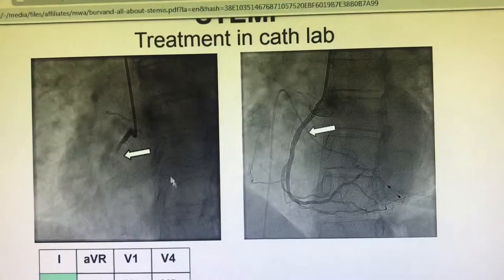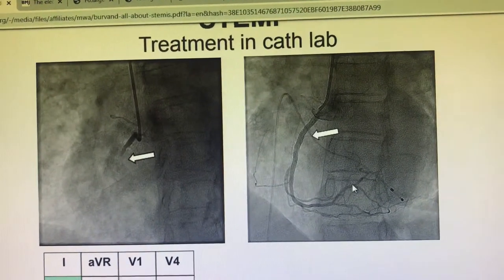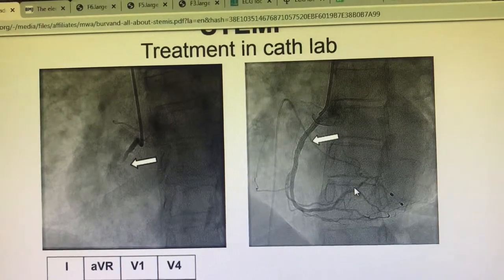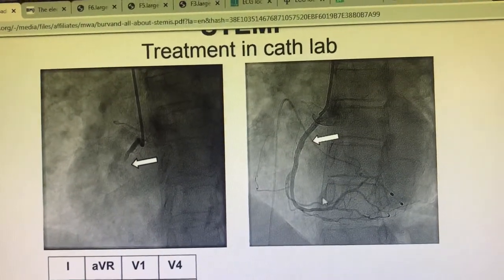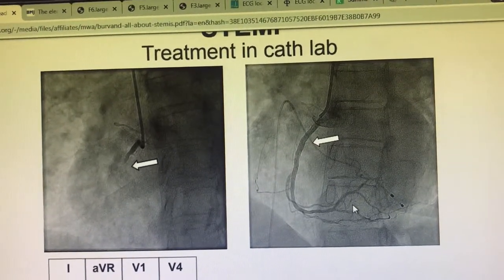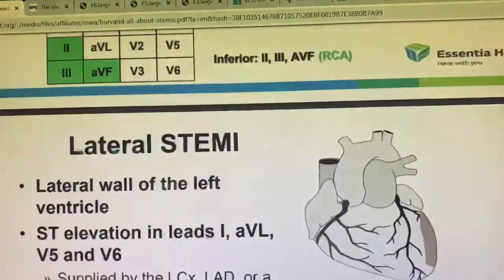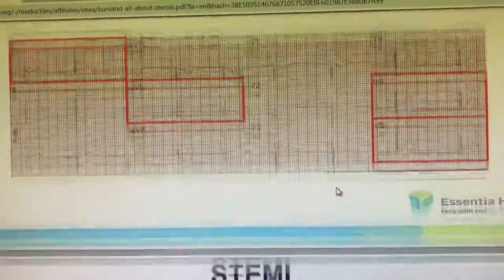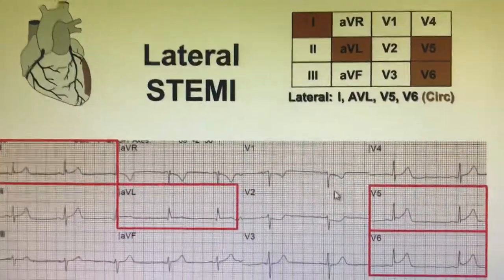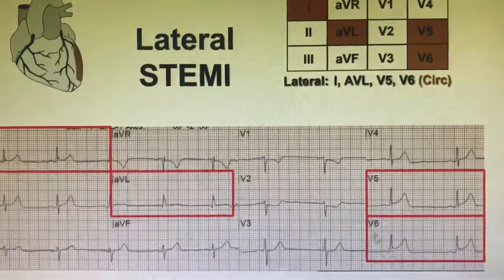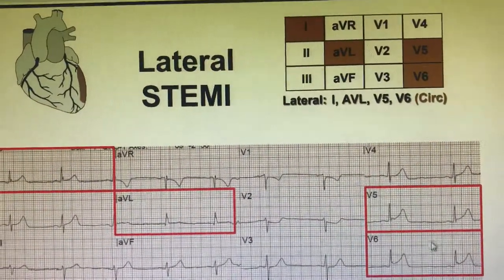Here is the same angio — the proximal RCA is affected. There is a hyper-dominant RCA, so it is affecting the posterior wall, inferior wall, and a slight portion of the lateral wall as well.